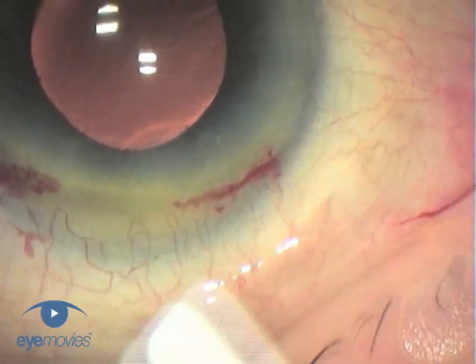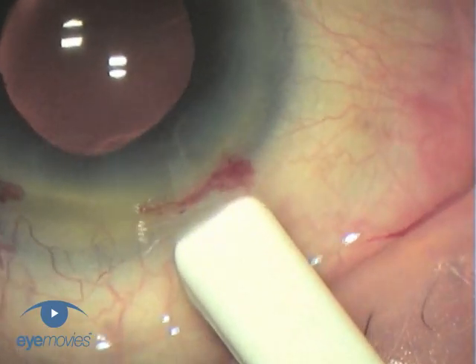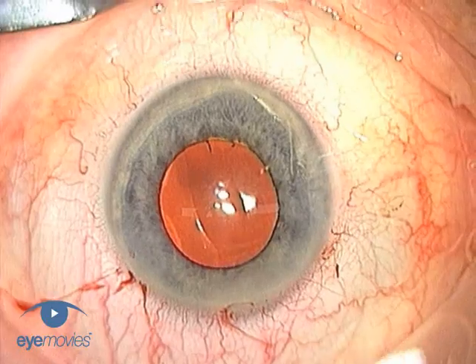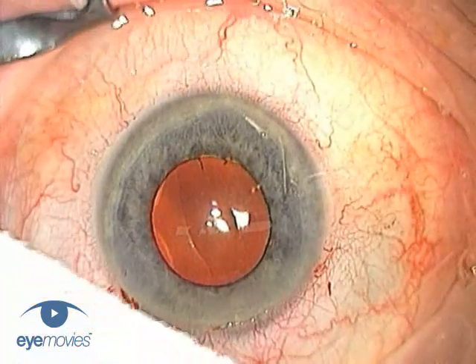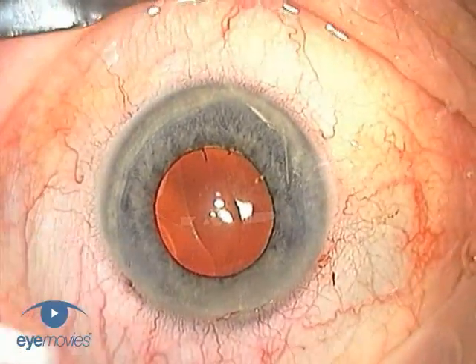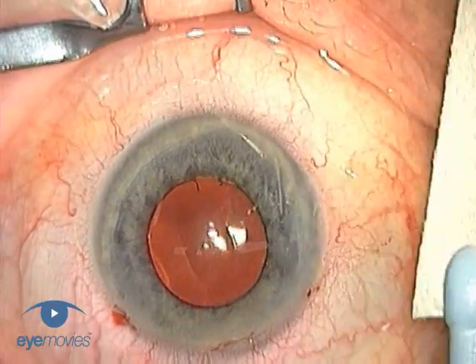You should check religiously that all the incisions are watertight at the end of surgery, and you can do this by one of two following methods. The first is by using a dry swab at high magnification. If there's any leakage, then the wound needs to be further hydrated to close the tunnel, and then retested to be certain the leakage has stopped.